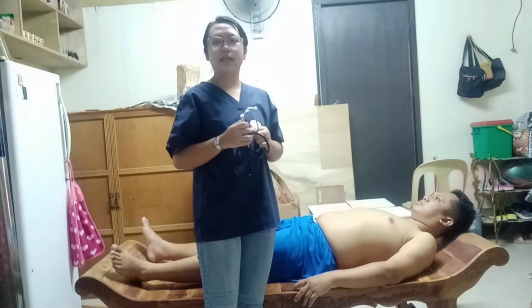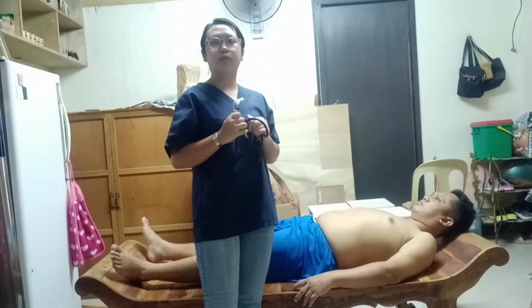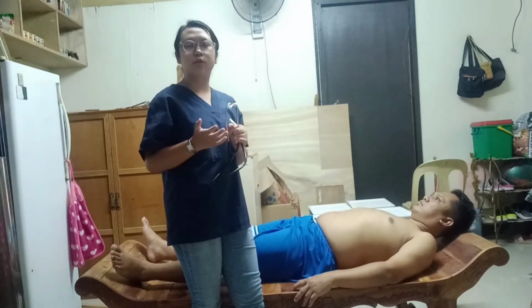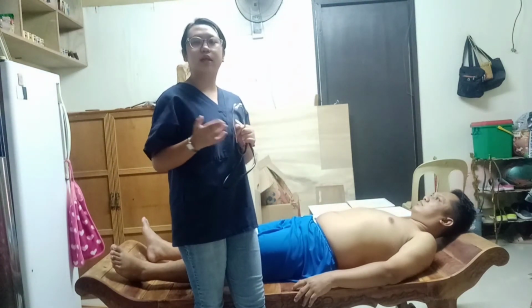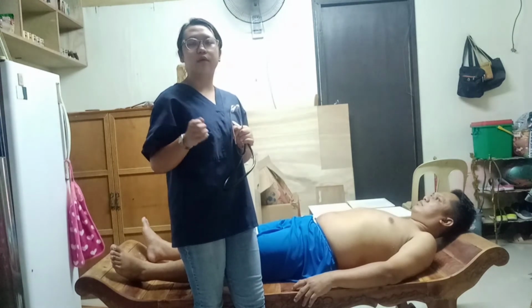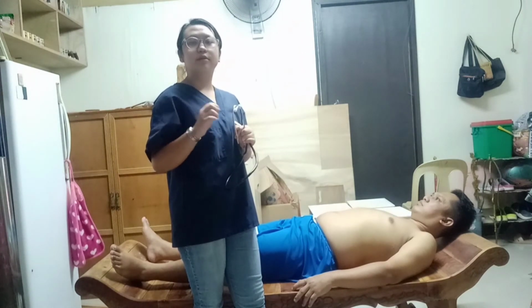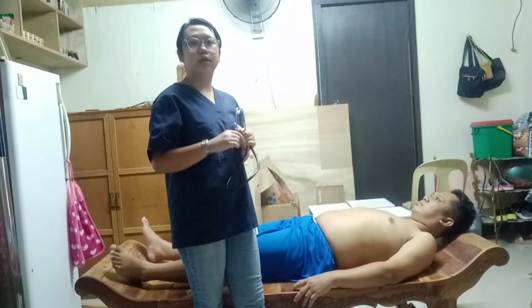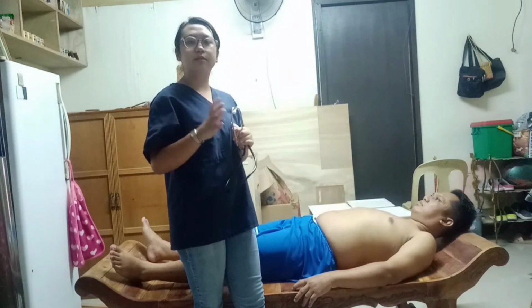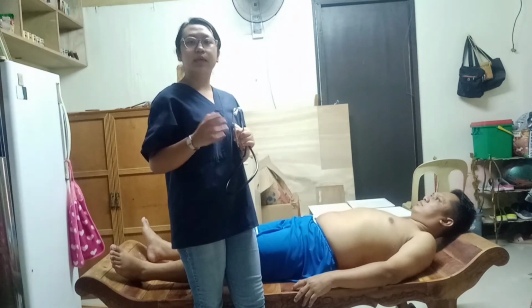After auscultating the apical pulse of my patient, I'm going to auscultate also the aortic, which is the second intercostal space on the right sternal border, followed by the tricuspid, which is the fourth and fifth intercostal space on the left sternal border, and the mitral valve, which is the fourth and fifth intercostal space, but on the mid-clavicular line.